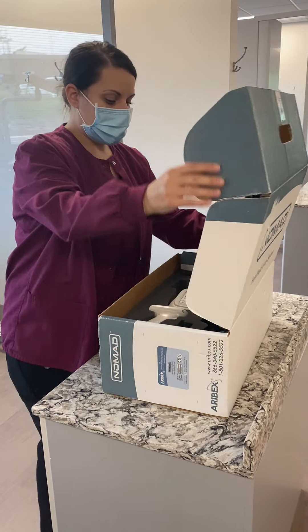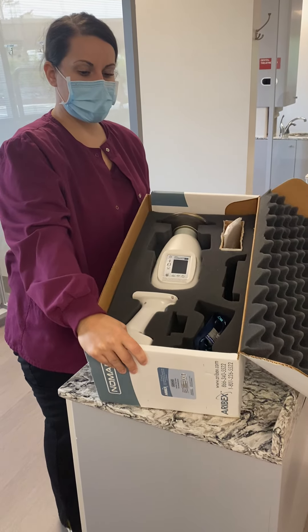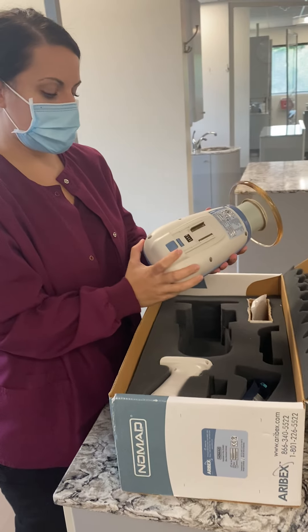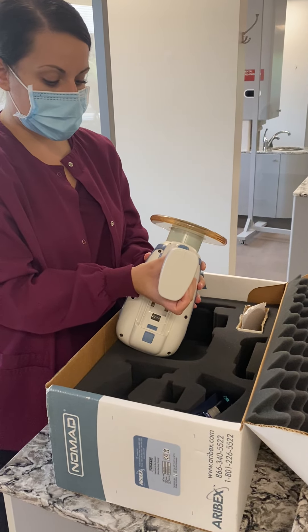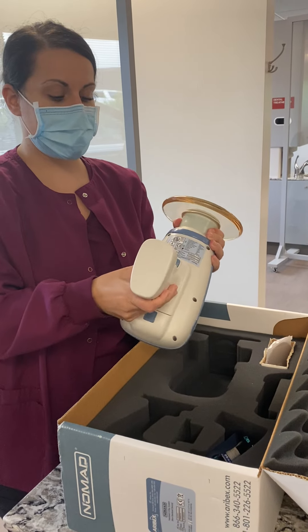So I'm just going to open it up. As you can see, it fits inside just like a puzzle. I'm going to take it out and attach the handle, which is the battery. When you attach it, you want it to slide just like a lock-in key until it clips. Now we know it's secure.